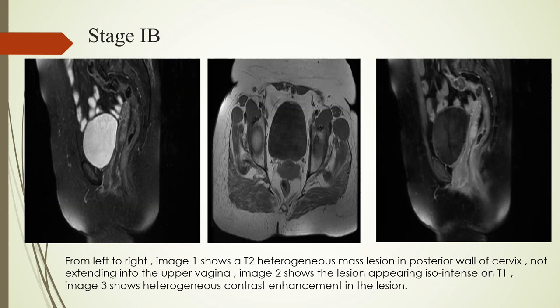This is an image of stage 1B. In image 1, a T2 heterogeneous mass lesion is seen in the posterior wall of the cervix, and the lesion is not extending into the upper part of the vagina. This is a T1-weighted image and the lesion is iso-intense, while in the post-contrast images, there is heterogeneous enhancement of the mass lesion, and stage 1B was assigned to the lesion.